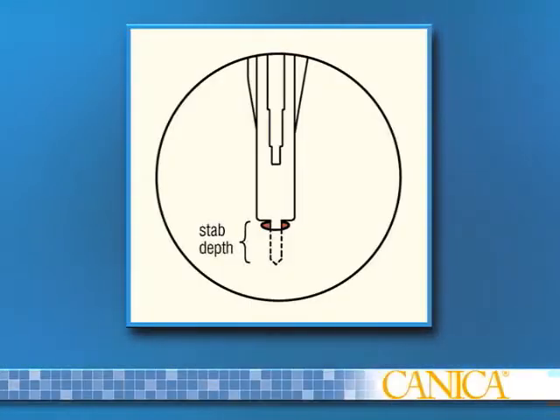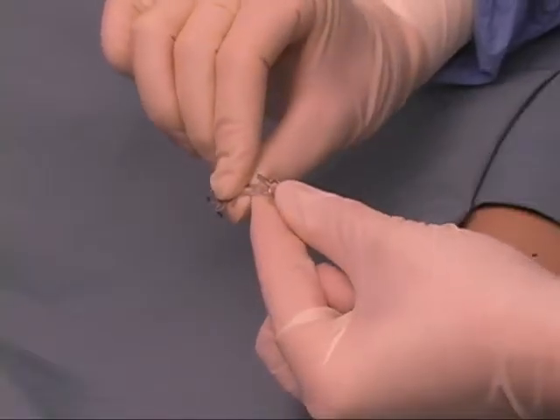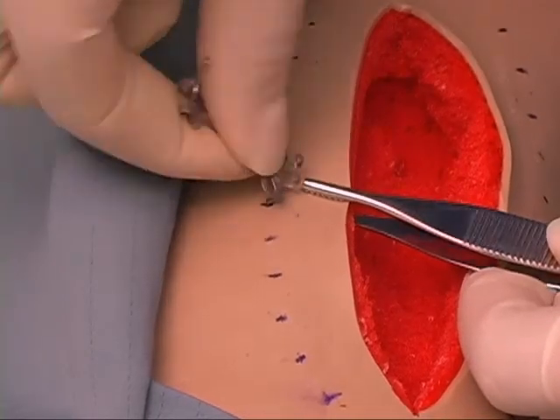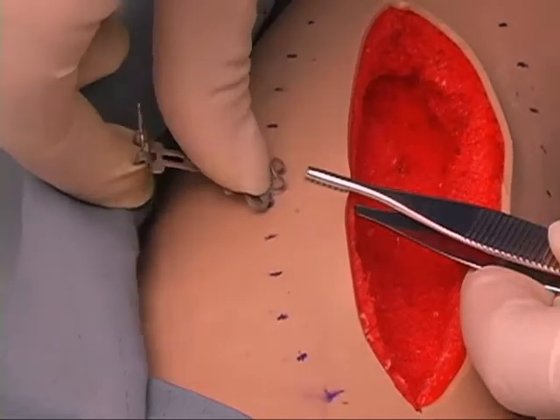Proper stab depth is achieved when the lancet is inserted up to the shoulder of the blade. When required, bend the body of the skin anchors to match the curvature of the skin surface. While tensioning the skin edge, insert the skin anchors into the holes.